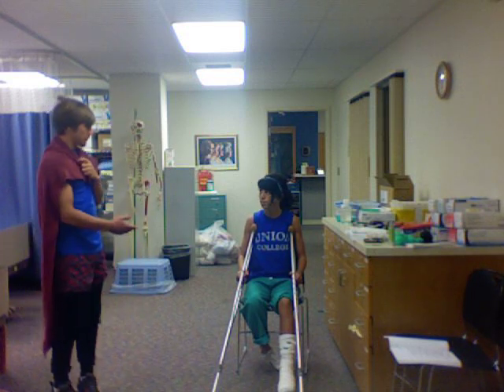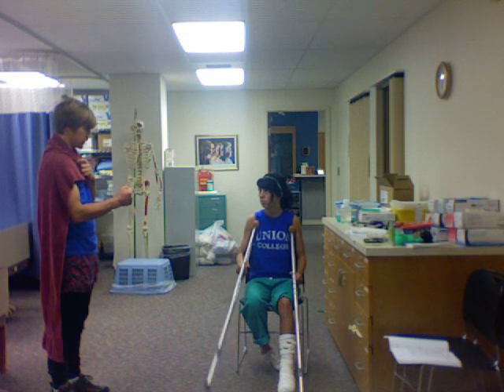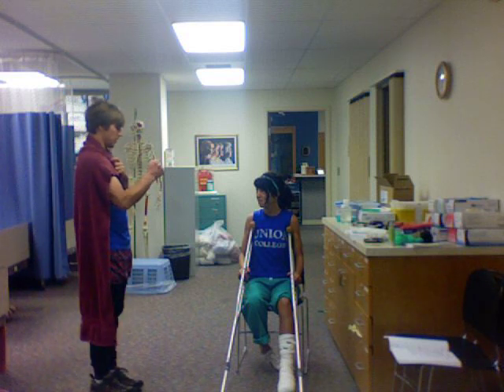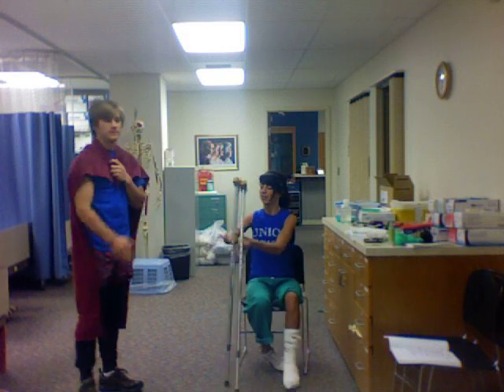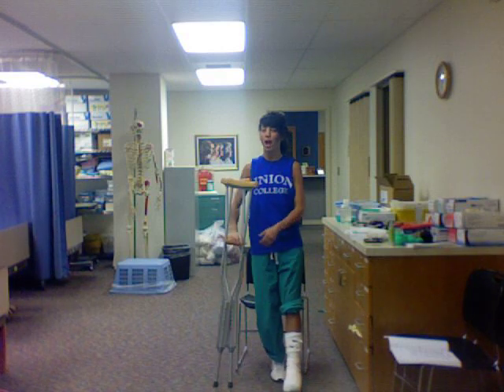Do you feel comfortable? Yes. Do you feel ready to conquer the world of crutches? Aye aye, Captain Crutch. Well, my day is done. And my lady, you may hop along home. Thanks, Captain Crutch.